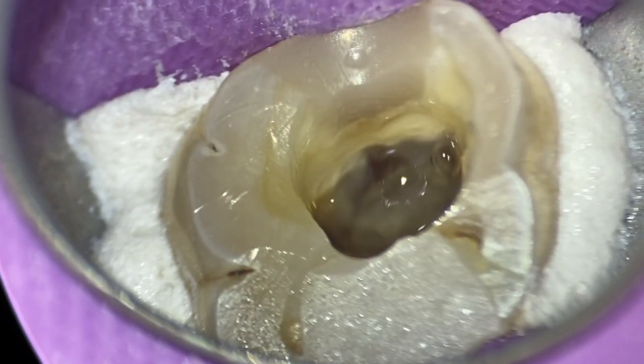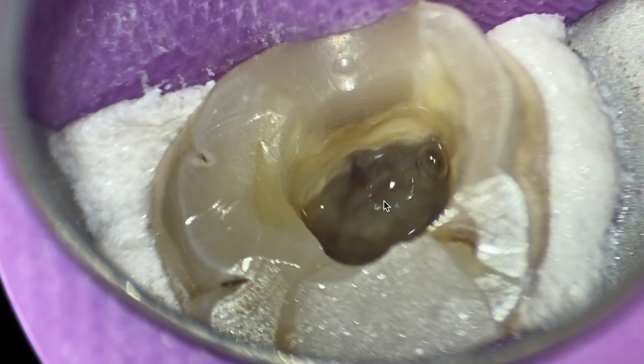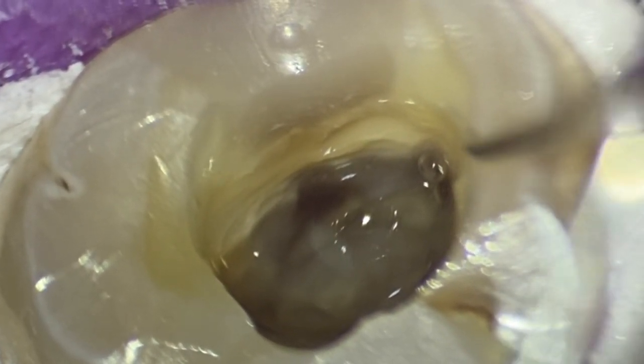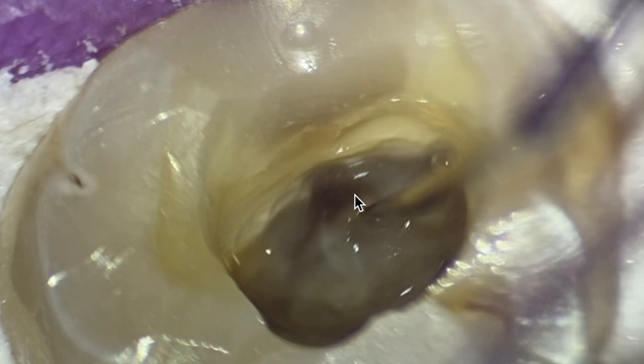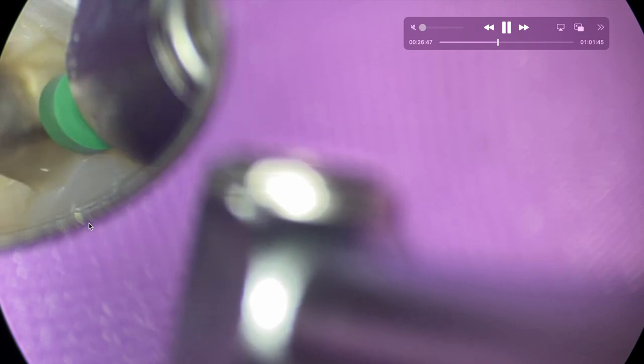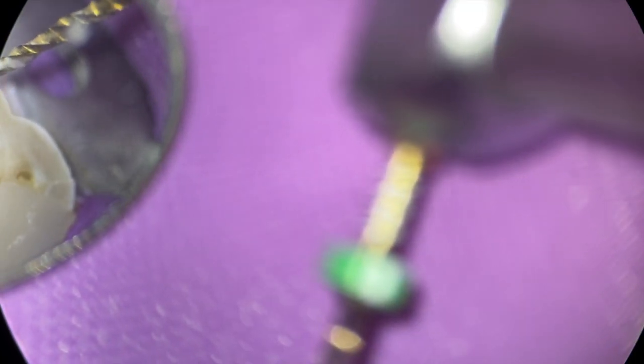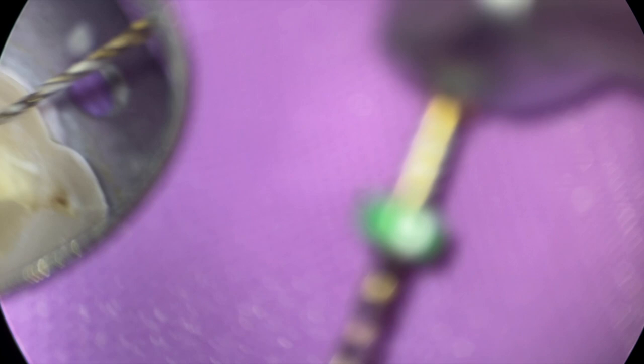What I'm going to do next is called the champagne bubble test. I rarely use this technique. I'm going to place sodium hypochlorite into the canal. What I'm looking for are little bubbles of organic debris that's being broken down by the sodium hypochlorite. I'm using full strength sodium hypochlorite and you can see it's not very clear, but there is actually some activity going on there. I'm kind of like, well, if I'm stuck on something and it's not going well, what I'll do is I'll switch up to give myself a little confidence boost.